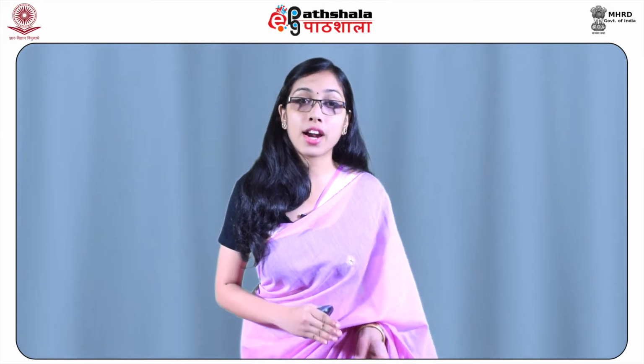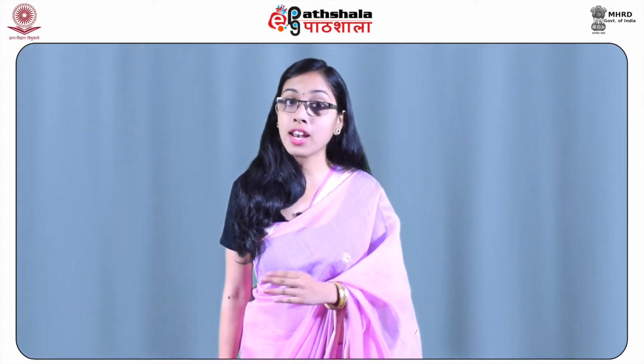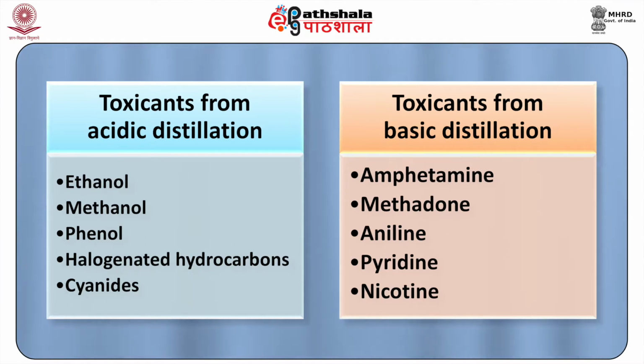Steam volatile substances can be separated or isolated from blood, urine and properly minced viscera by steam distillation. Steam is passed into the sample and the aqueous distillate is collected by the process of condensation. Toxicants from acidic distillation process include ethanol, methanol, phenol, halogenated hydrocarbons, cyanides, etc. On the other hand, the toxicants from basic distillation process include the basic drugs such as amphetamine, methadone and also aniline, pyridine, nicotine, etc.